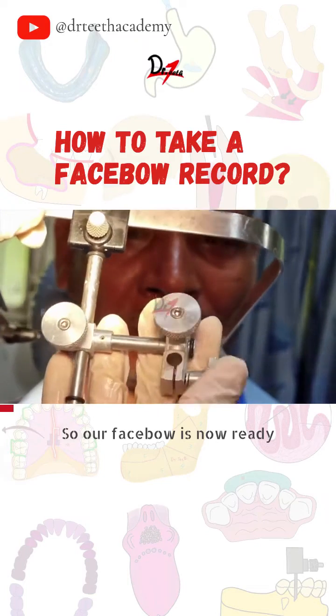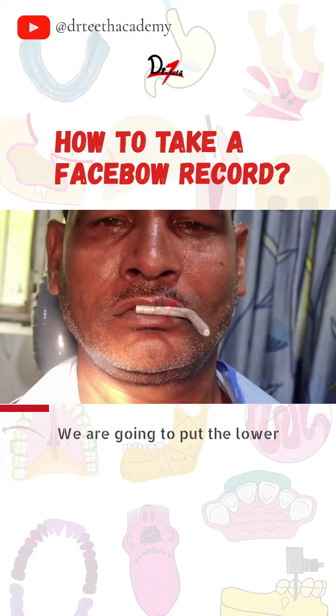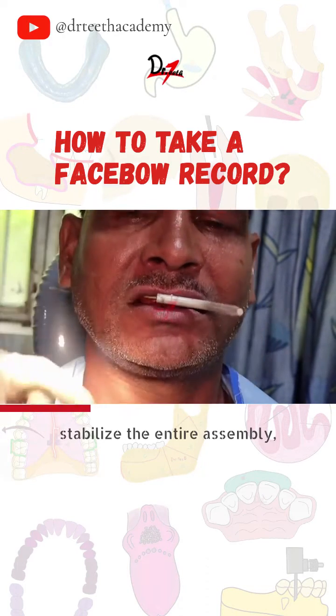Our face bow is now ready for the face bow record. We are going to put the lower rim so that the patient can bite onto it and stabilize the entire assembly.